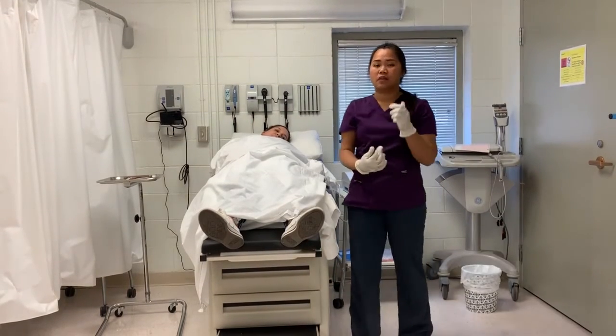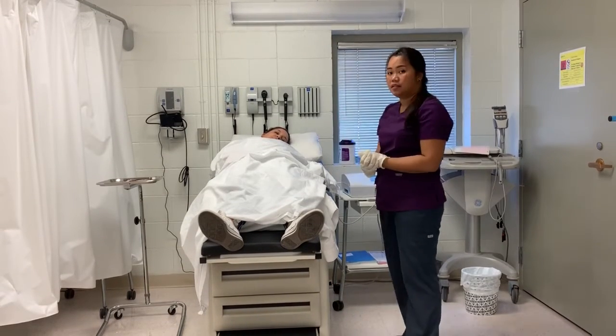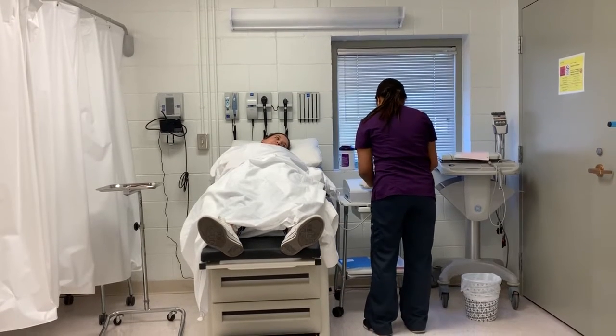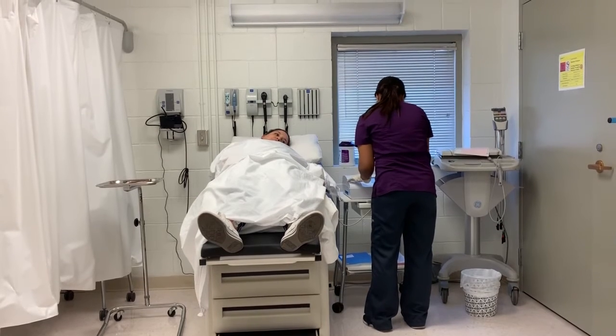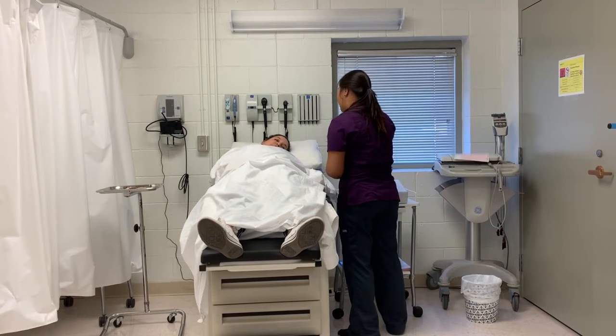Okay, now that I've placed all the lead wires, I'm going to go ahead and begin the ECG test. Okay, ma'am, will you hold still for me for a moment? Yes, ma'am.